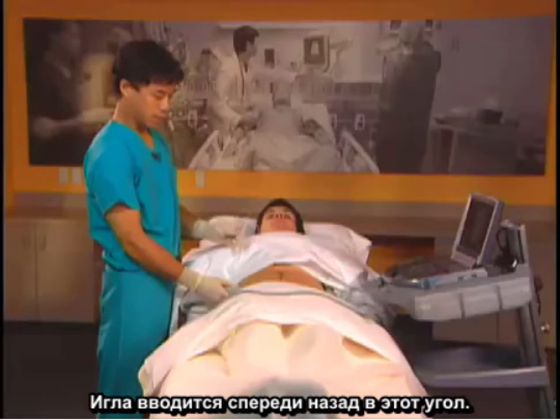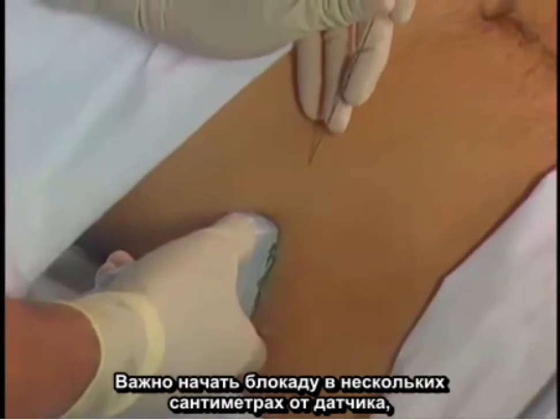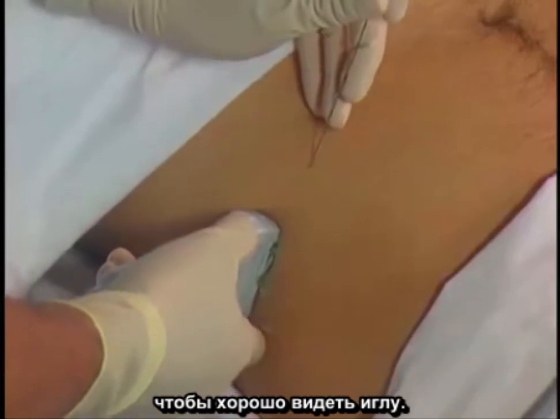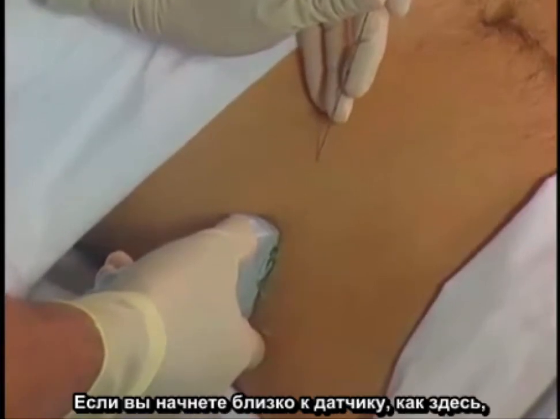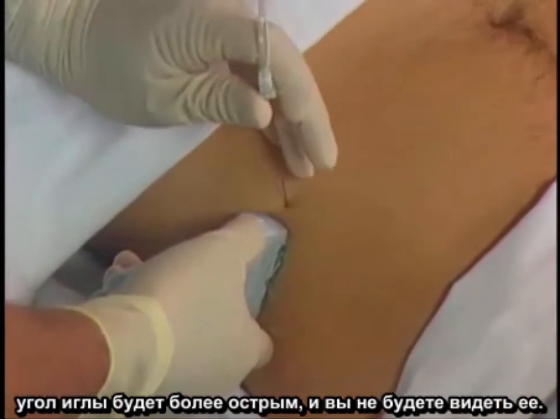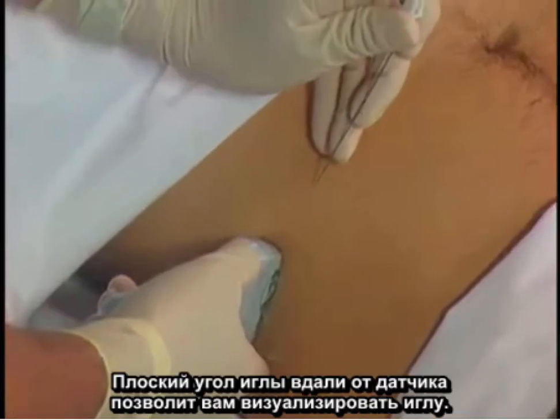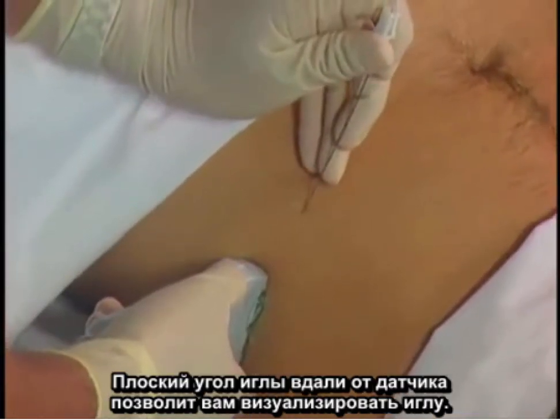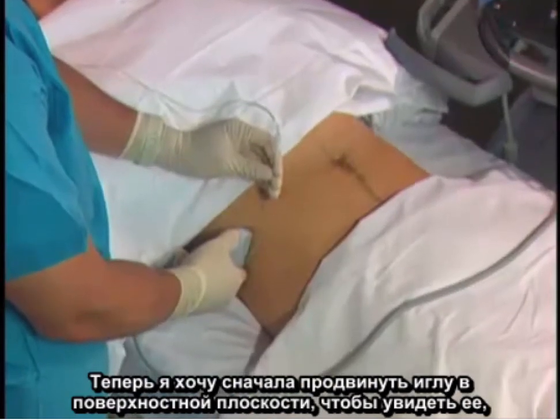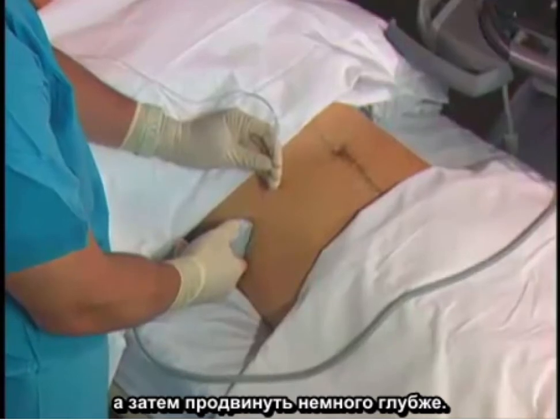My needle approach is going to be from anterior to posterior. It's important to start several centimeters away from the probe for this block in order to see the needle well. If you start too close to the probe, you'll have a sharper needle angle and will not visualize your needle as well. Flat needle angles far away from the probe will allow you to visualize your needle. I like to advance my needle in a shallow plane to view it first, and then advance it a little bit deeper.